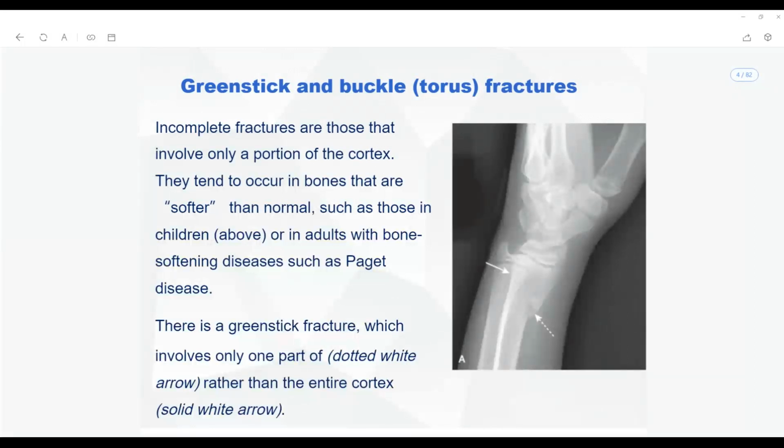Then rule number 5: always compare your skeletal radiographs to the symmetry and the previous studies. Always necessary. Then rule number 6: confirm your diagnosis on a higher modality. Perfect. Those are all the 6 rules. Do not ever forget these rules in your clinical practice.